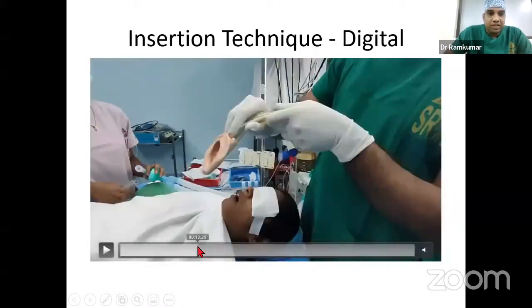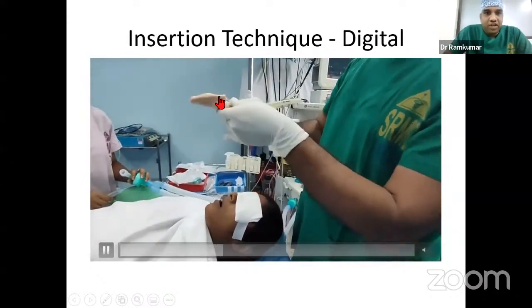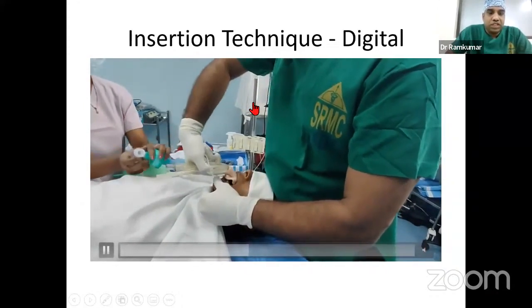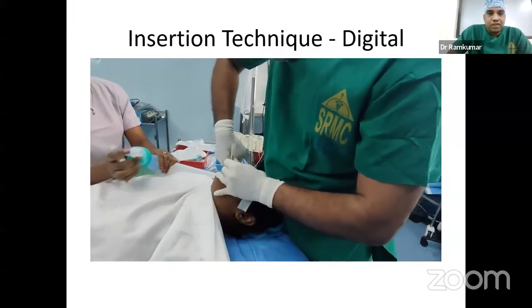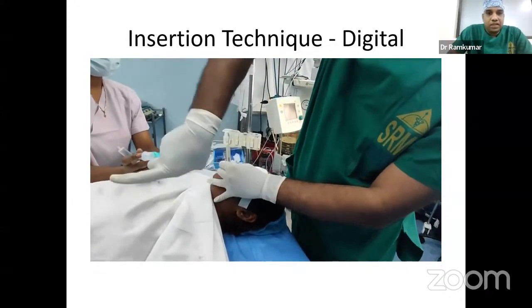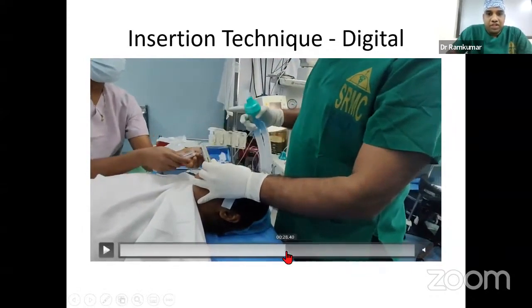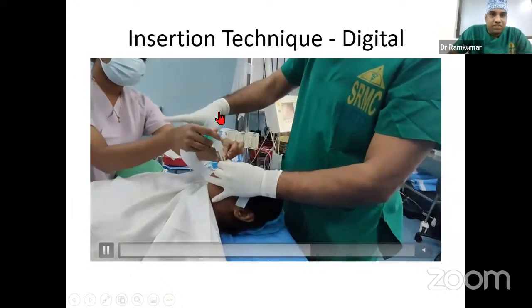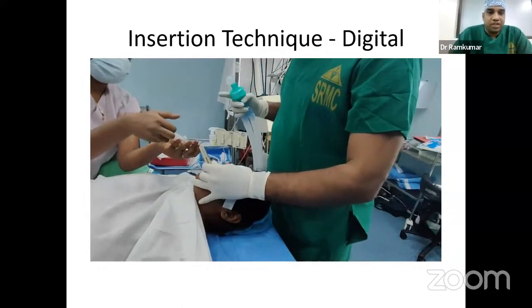You place a finger at the place where the metal handle can be fixed, and the ProSeal LMA is holding the device. Mouth open is achieved. Sniffing position is important, mandatory for this. You take the mask along the palate, not anteriorly, because once you go anteriorly, you can tend to drag the tongue. And once you place your fingers, the movement is like your interphalangeal joints are extended and the wrist is flexed. So you guide till you get a resistance.